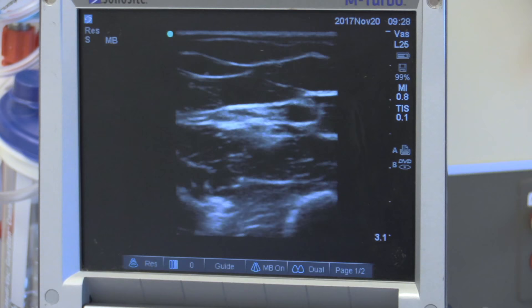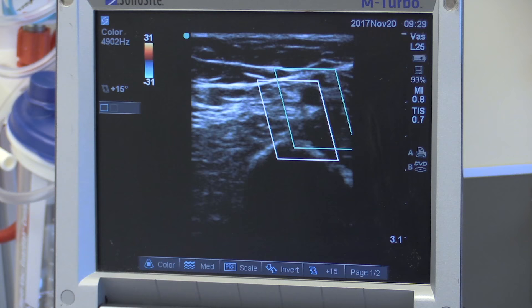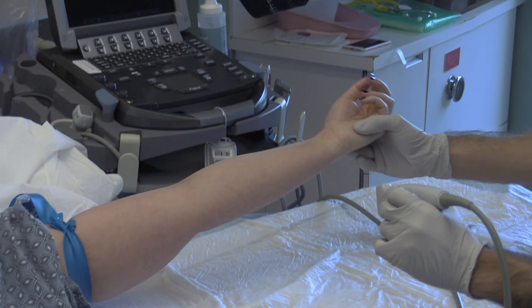It is important to verify that the target structure is venous. It should be fully compressible and non-pulsatile. Locate the relevant brachial, radial, or ulnar artery to assure yourself that you will not cannulate these structures. When in doubt, you can use Doppler or color flow to confirm arterial versus venous flow. Pulsatile flow is suggestive of an artery and these vessels should be avoided. It's often safer and easier to cannulate veins that are farther away from arteries.